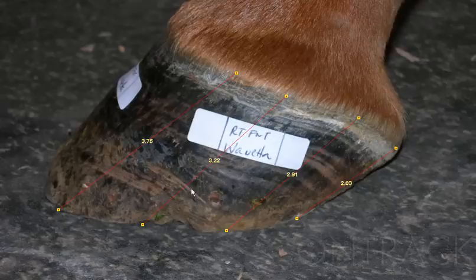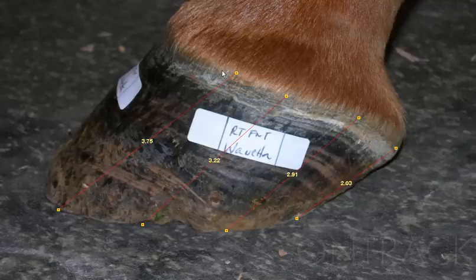Juanita came to me with a right front lameness in the foot. We took pictures of the medial and laterals for graphing purposes. As you can see in this image, it appears as though the heel is high.